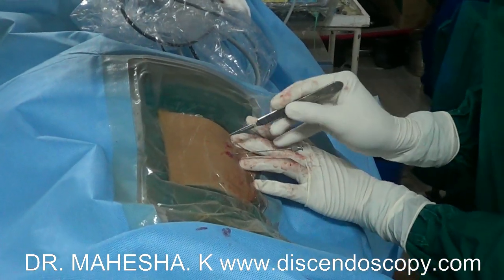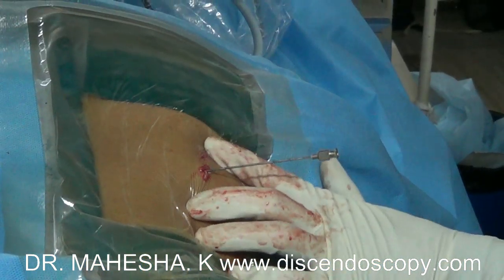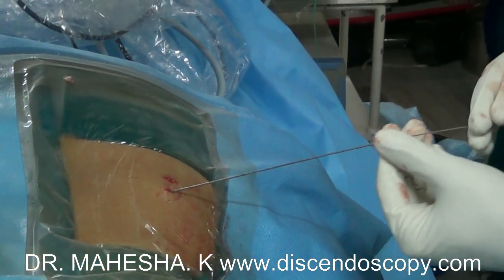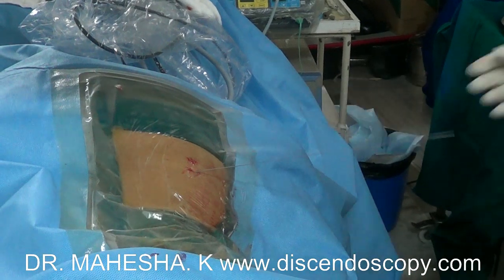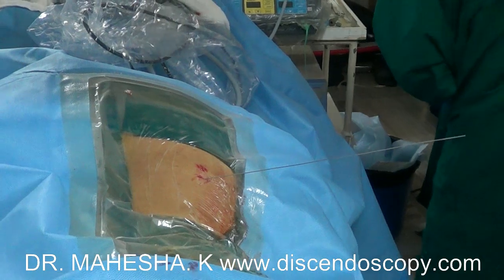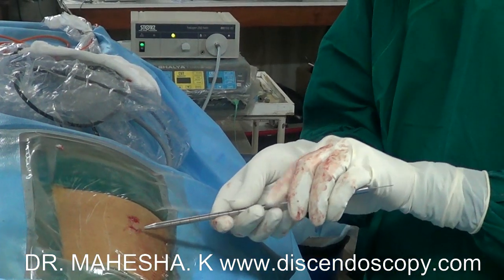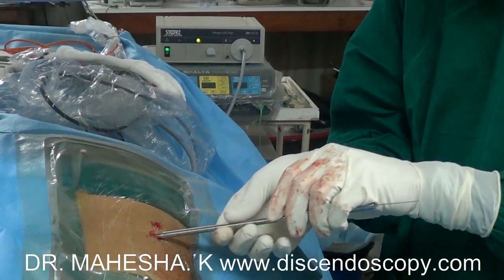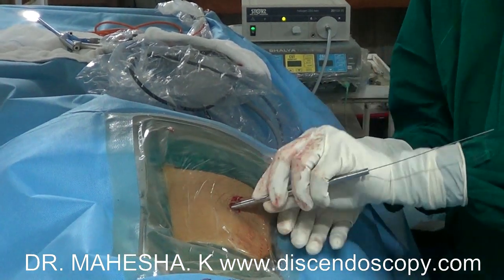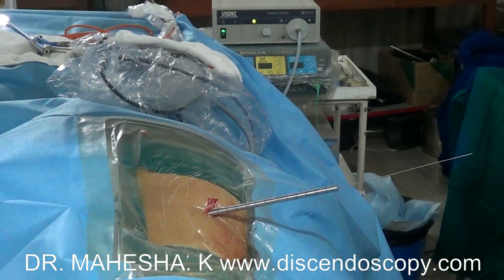The needle has to be in the posterior curve of the disc space in lateral view and in the center of the disc space in AP view. The needle is then replaced by the guide wire. A dilator is inserted over the guide wire into the disc space under image control.